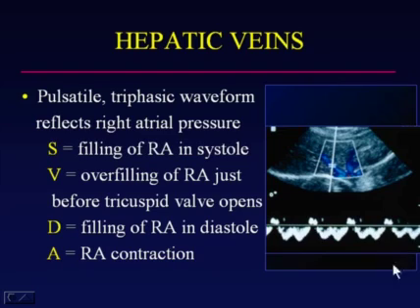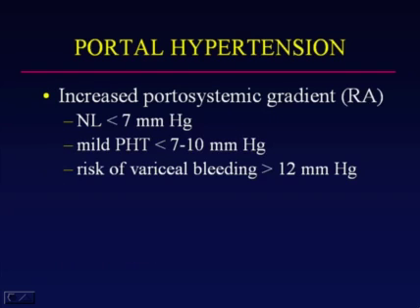direction. And here is a waveform from one of the hepatic veins, and you can see again the S wave, the V wave, the D wave, as well as this A wave corresponding to the right atrial contraction or atrial kick. How do you define portal hypertension?